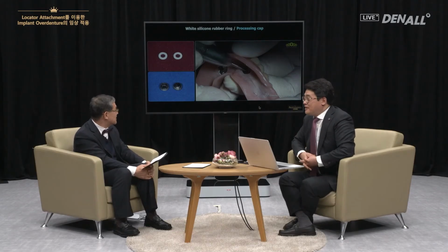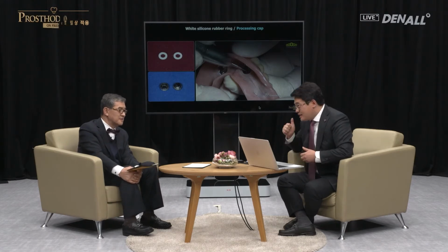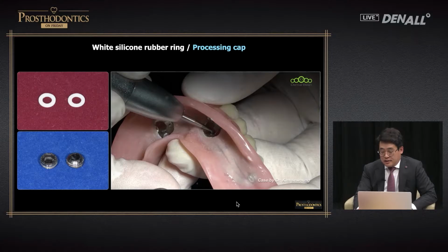The processing cap was in contact with a metal framework, and it was adjusted and passive fit was gained. This is important to attach the processing cap.